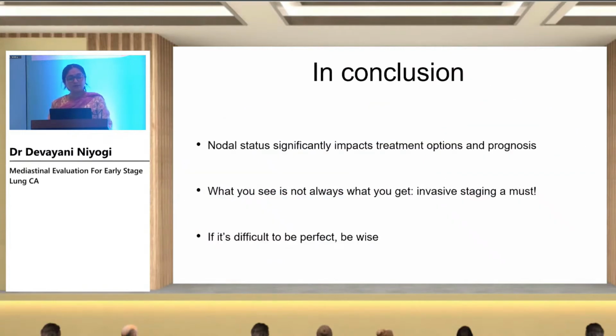I'd like to conclude my talk by saying nodal stages significantly impact treatment options. There's no doubt about that. It also helps you to prognosticate your patient, so it is something that needs to be done diligently. What you see is not always what you get on the PET scan. So we know that invasive staging is a must. There is no getting around that.